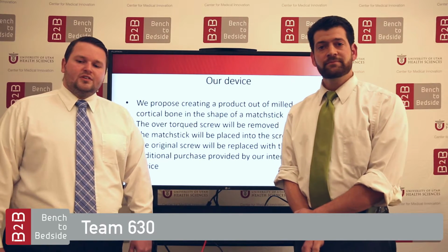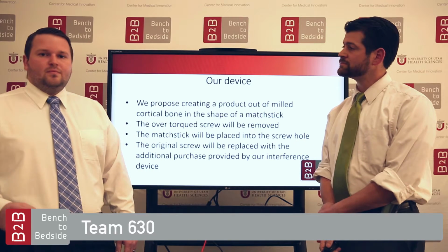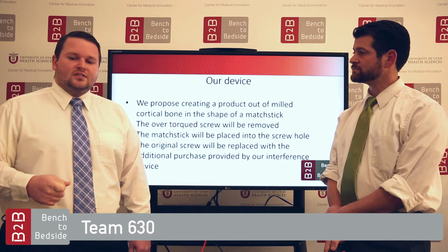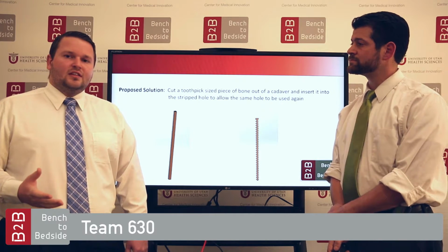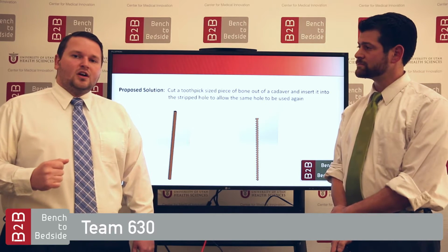So what we propose is to mill a piece of cortical bone out of a cadaver into a shape much like a matchstick so that you can remove the original screw, insert the device, and then reinsert the same screw into the same hole. We have two different ways that we want to do this. The first one is just a simple rectangle, much like the existing matchstick.